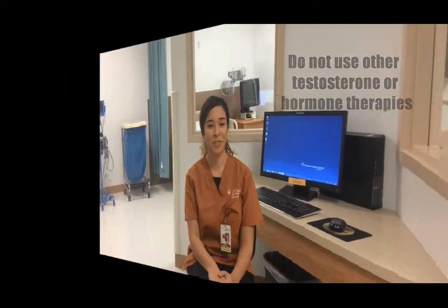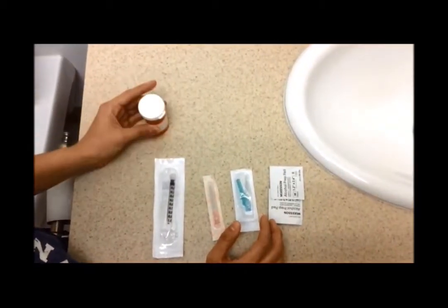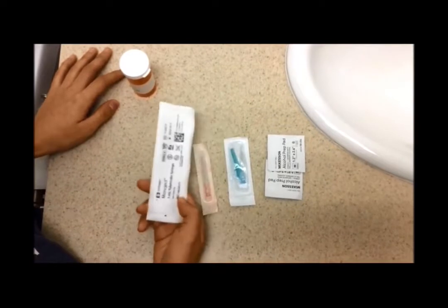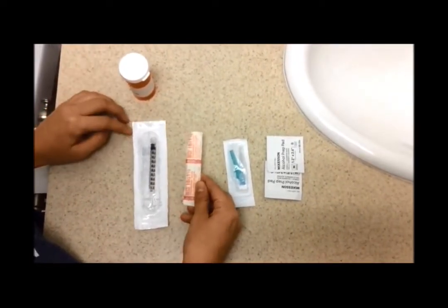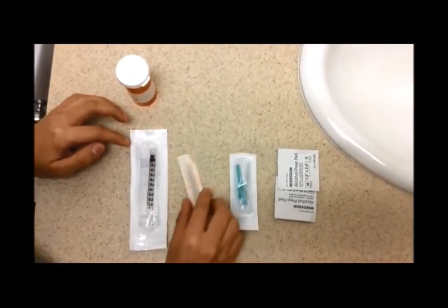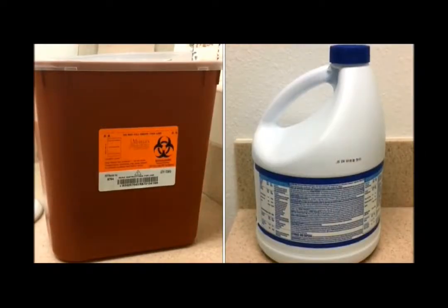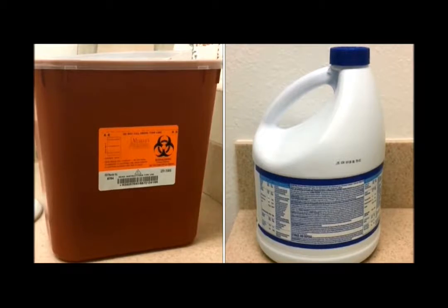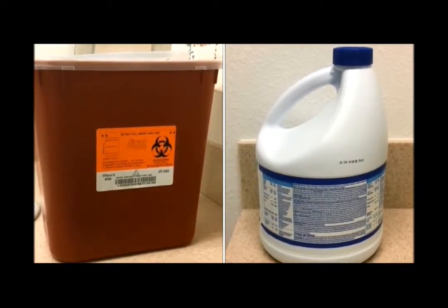Now let's look at the process for an IM injection. Before you begin, clean your workspace area and wash your hands. You will need your testosterone vial, a 1 milliliter syringe, an 18 gauge fill needle, a 23 gauge injection needle, alcohol swabs, and an appropriate sharps disposal container. Keep in mind that you'll need to use a brand new needle every time. Not only does this keep you from getting an infection, it also hurts less.